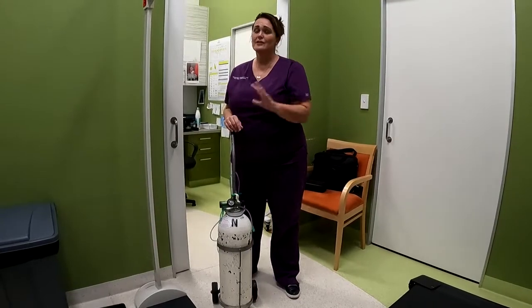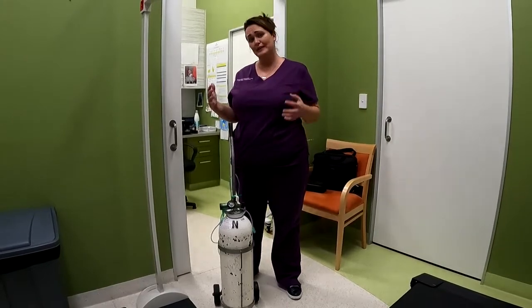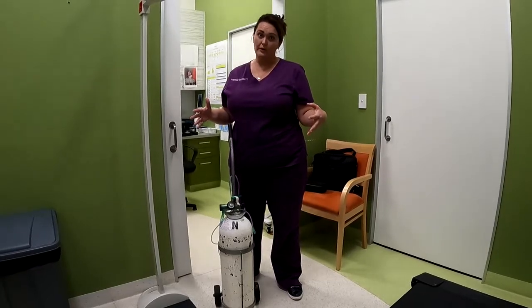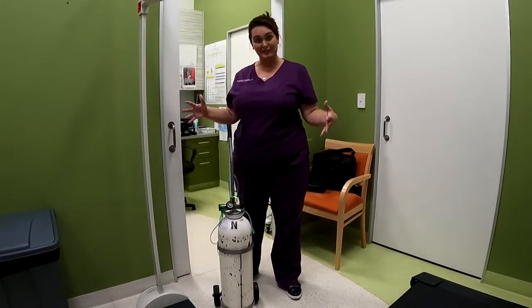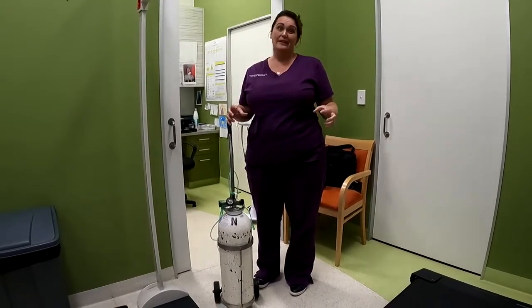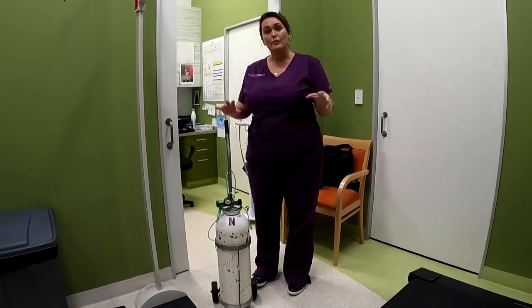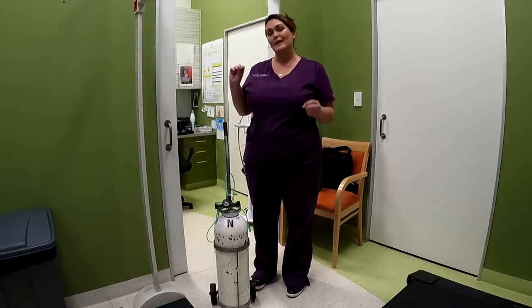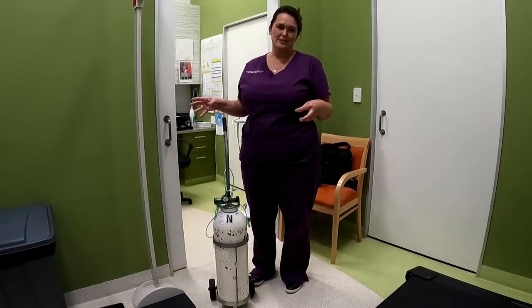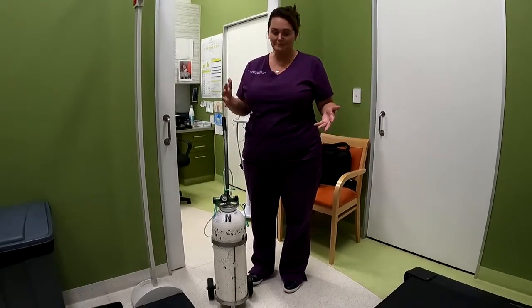As I mentioned, the oxygen technician will go through everything with you regarding your tanks, but there's a couple of things I just wanted to make sure you understand. Depending on how much oxygen your baby is on will depend on how many tanks you get. But generally you'll get 2 quite big tanks and then 3 to 6 portable tanks, depending on the flow that your baby's on. They'll go through with you when they deliver your oxygen where's the best place in your house to put the tanks, depending on where your baby's going to be doing most of their sleeping and where you'll be doing most of awake playtime.